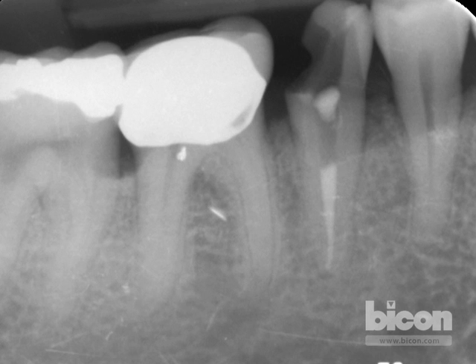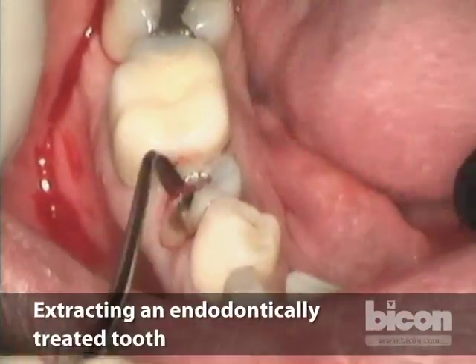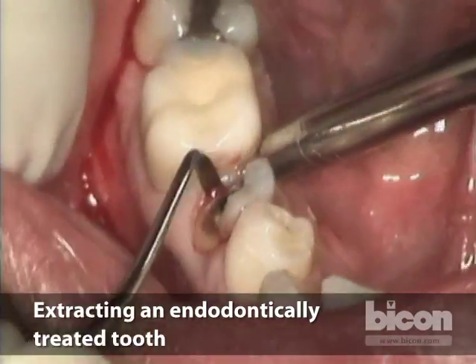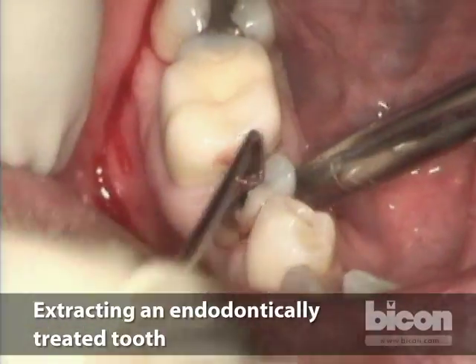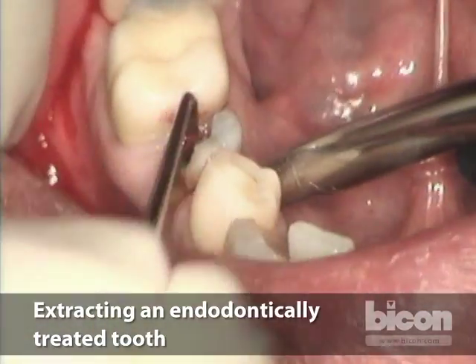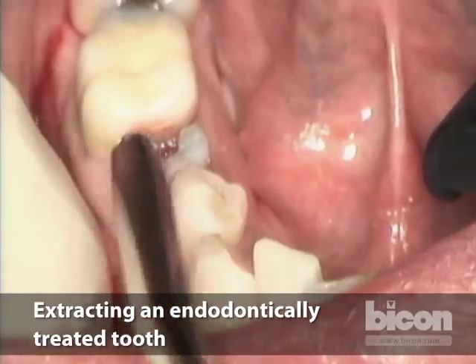We are ready now and will be proceeding to the surgical room. The atraumatic extraction depends on avoiding all flaps and taking our time to sever all of the periodontal ligament, or as much of it as possible, so that the tooth is mobilized without having to torque against the surrounding bone or the socket at all.